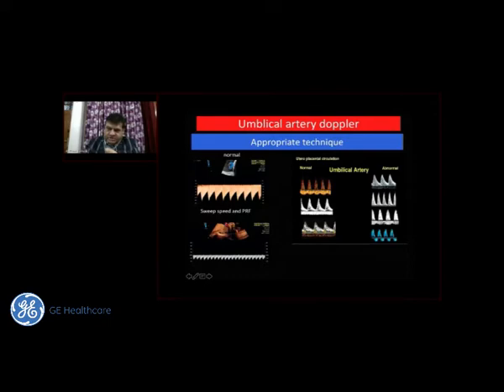This is where the diastolic flow is 0, which means that it is absent end diastolic flows. And this is where the diastolic flow has gone below the baseline, which means that it is reversed end diastolic flows. We will talk about all of these situations once Dr. Chander Lulla takes it, and then we can take it in the panel discussions.